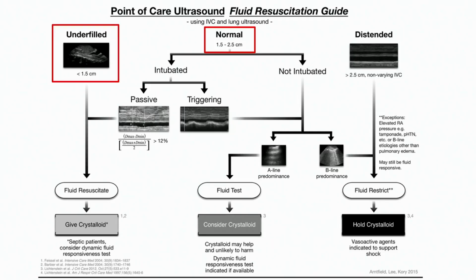So flat, we're going to call underfilled. We're going to say the IVC is less than 1.5 centimeters. If it's less than 1.5 centimeters, you can pretty confidently say that if you fluid resuscitate your patient, their hypotension will improve at least somewhat.